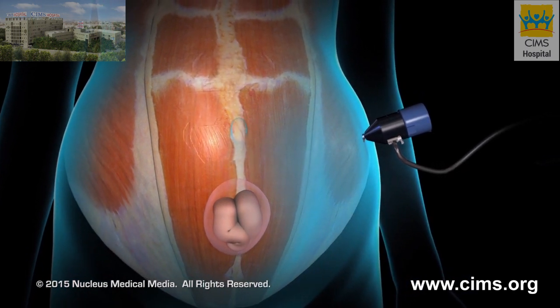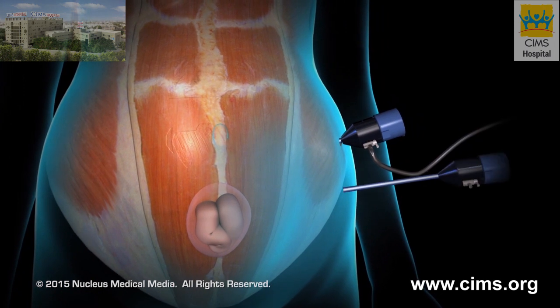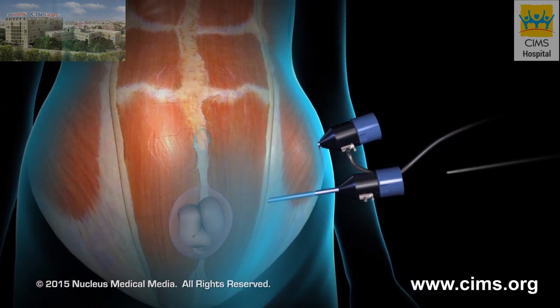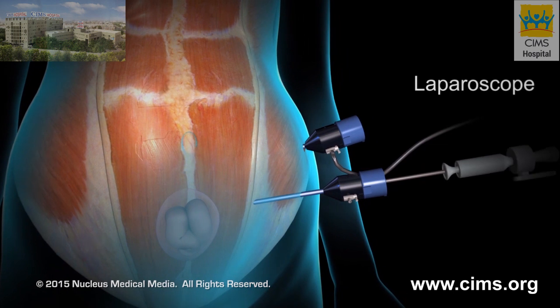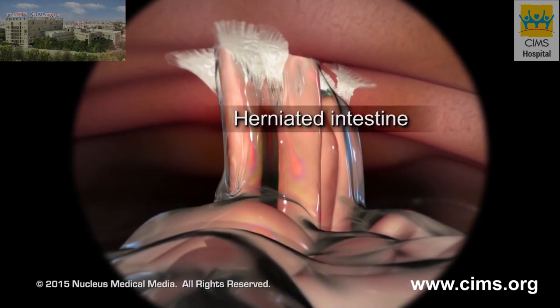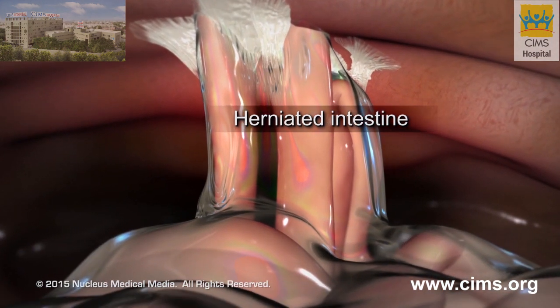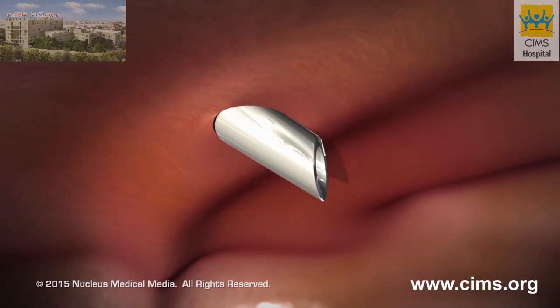Next, your surgeon will make another incision and insert another small port. Through this port, your surgeon will insert a laparoscope, which is a tiny camera that projects images onto a monitor to guide your surgeon's work.